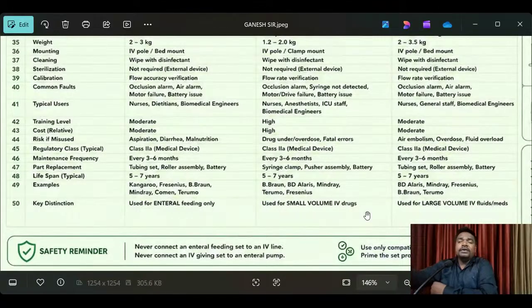So here you can understand, there are multiple types of electronic medical equipment available. Whatever organs we have in our body, based on those organs we have different equipment for diagnosis, treatment and surgery. We have multiple technologies. Next one, we come to the infusion pump.